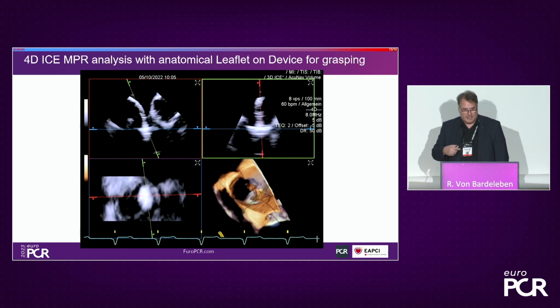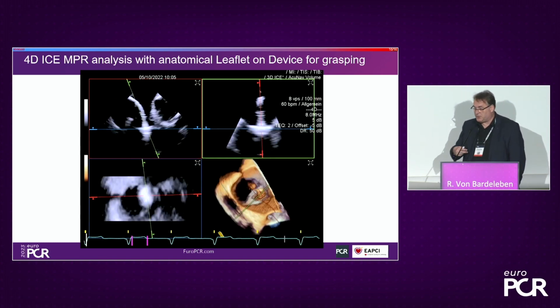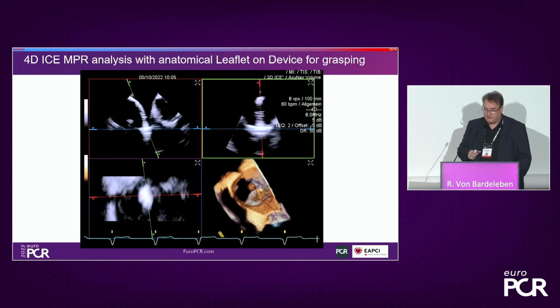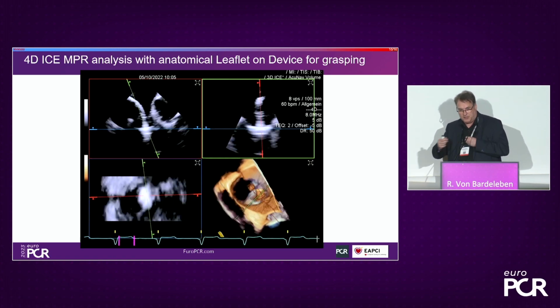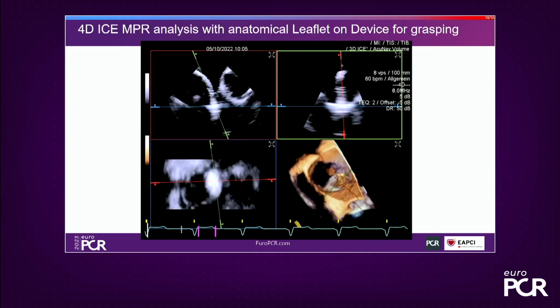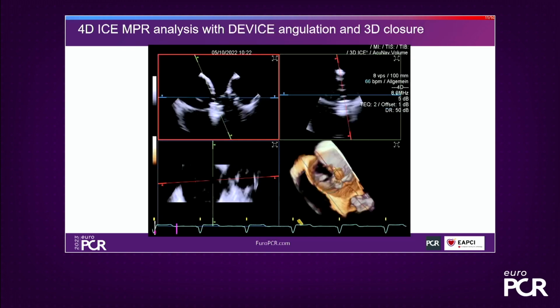So everything is done out of a right atrial position of an ICE probe, so you avoid a certain number of steps, which can also cause bleeding, because typically these patients are congested with tricuspid valve regurgitation. So very often, especially in centers that start, you move into the transgastric and out, you forget to unband or whatever you do, you can cause gastrointestinal bleeding. And this is totally avoided with this technique. You just add a second venous puncture to the groin on the contralateral side.